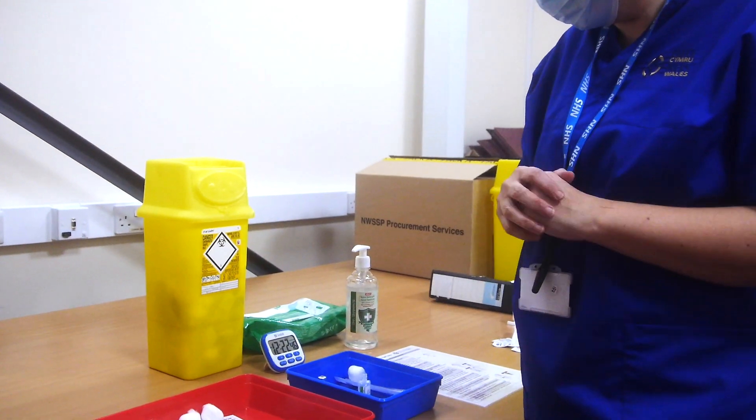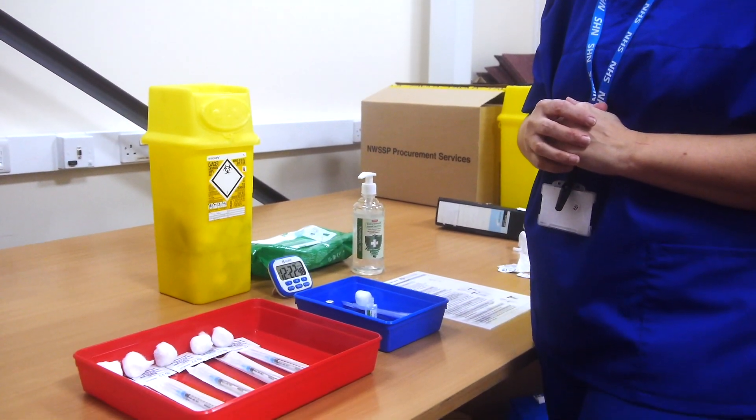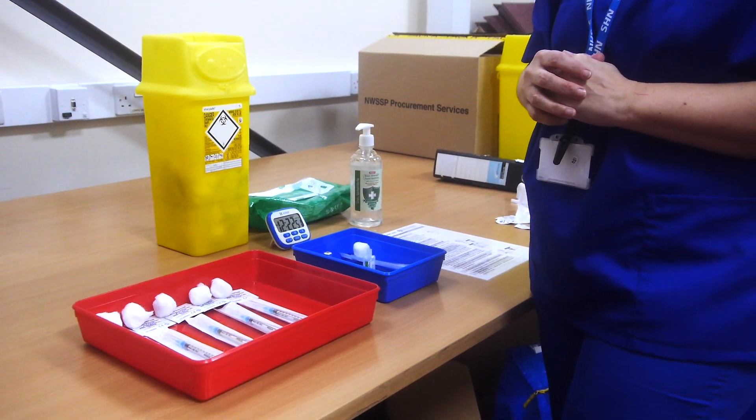We now need to prepare the saline. You must allow your vial 30 seconds to dry at air temperature before you withdraw any vaccine from it.